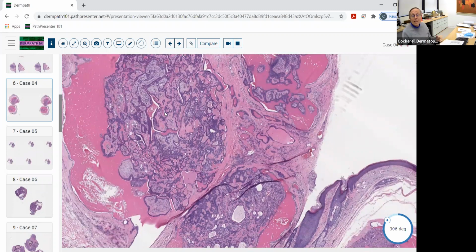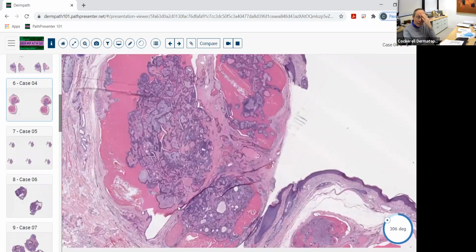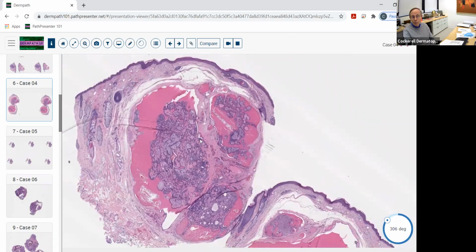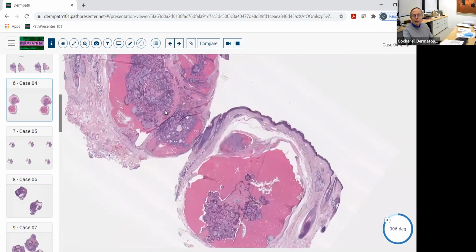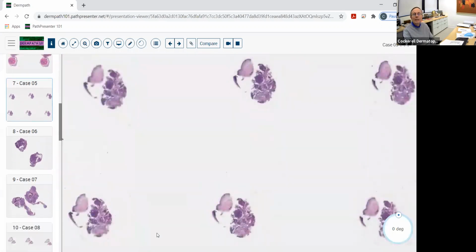And you can just name it yourself. So you don't have to worry about what it is. You can figure it out by using your criteria to give it a name, so that if you look at it on a multiple choice question, you can actually get the answer right on a board examination. It's totally benign, vertically oriented, well circumscribed, so we don't have to worry about this being malignant or anything. So basically papillated apocrine cystadenoma, another example of a benign adnexal neoplasm.